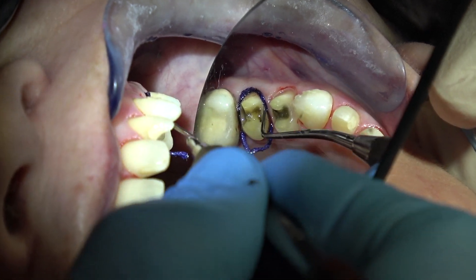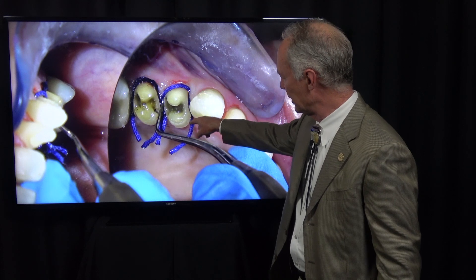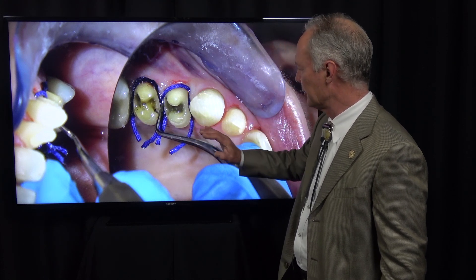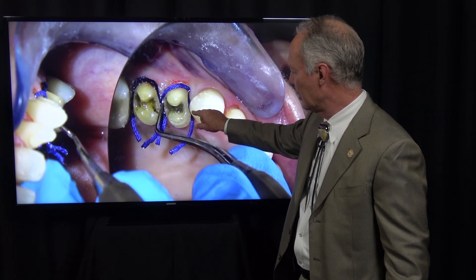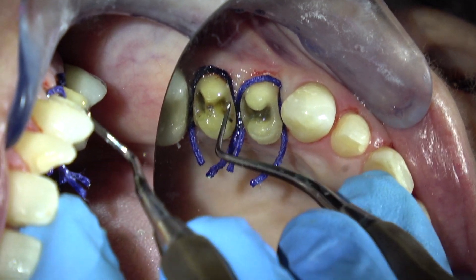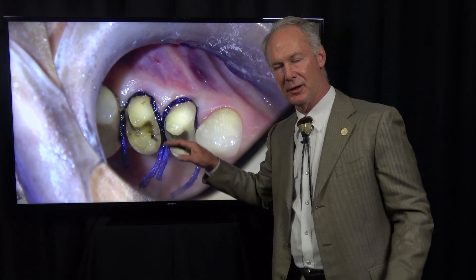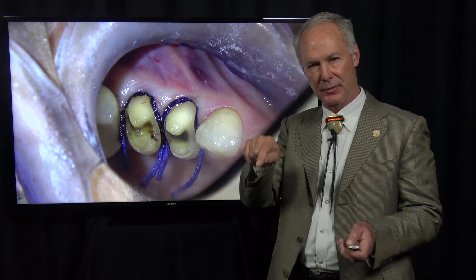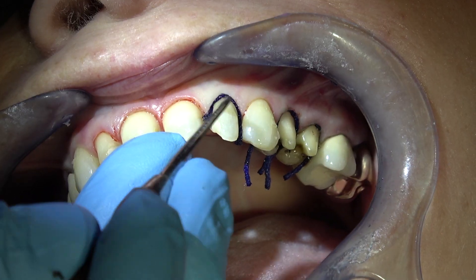I'm placing the cord around the full crowns. Because these are supragingival on the palatal, I don't have to place cord in the palatal sulcus — just the interproximal and the facial for the full crowns. You don't have to shove it way into the sulcus. You just want to expand it, open it, so the impression material or the scanner can get to the margins of the prep.